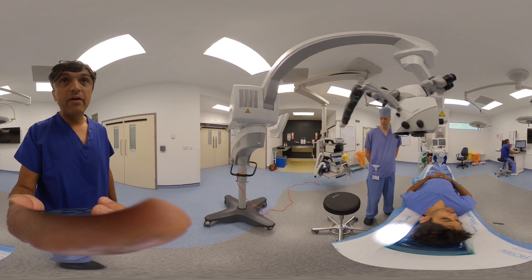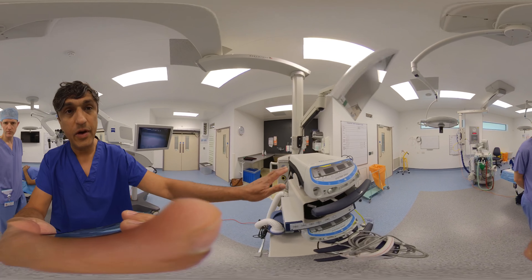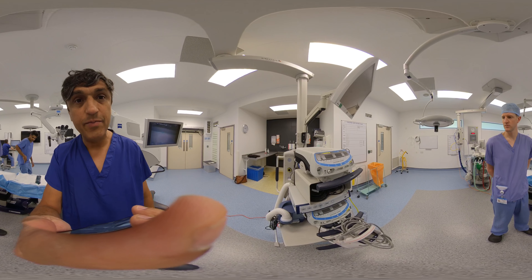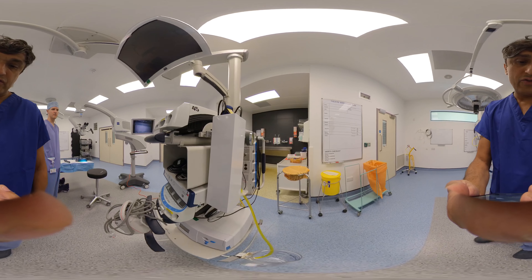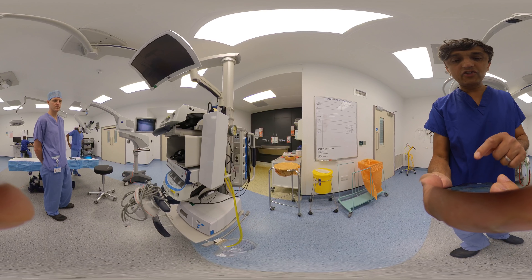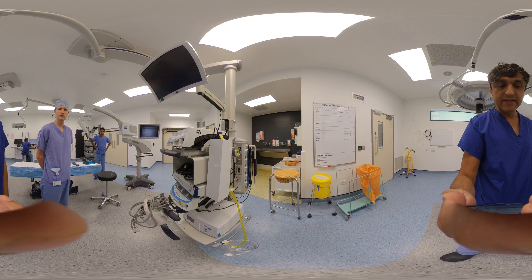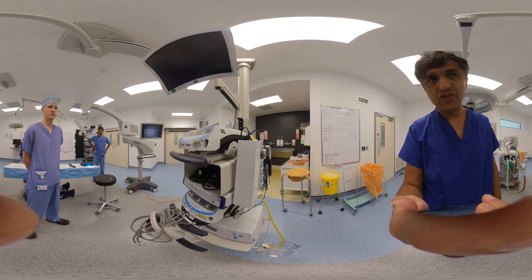The final things to comment on are the micro-suction and micro-bipolar. Set the bipolar down to seven or eight with very fine-tipped bipolar forceps. The suction also needs to be turned right down to low rates so that it isn't detrimental to the small vessels.